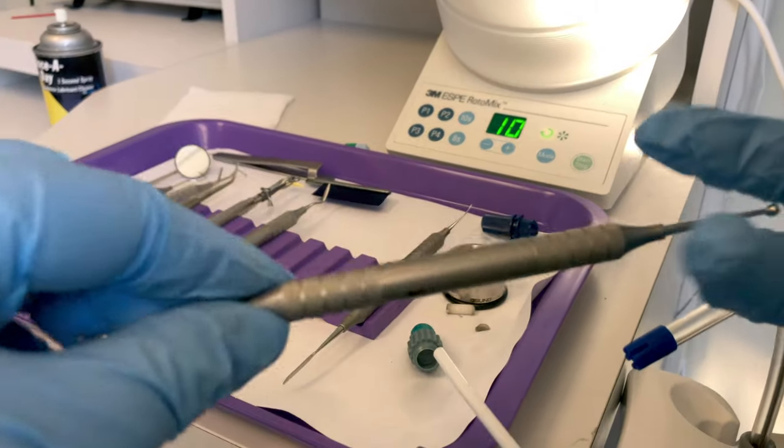As they're using the carver, we suction. Without cheeks of course, this is very easy on a mannequin, but your HVEs are very strong — use them to retract the patient's cheek, or use your finger to get into their cheek to retract. Place your HVE where you'll pick up the most scrap amalgam being carved off the tooth. When they are done carving, they'll probably ask for the burnisher — take away the cleoid discoid and deliver the burnisher. Keep your HVE in position and keep the carver in your hand because they may need it back. This is where your single-handed instrument transfer will come in handy.